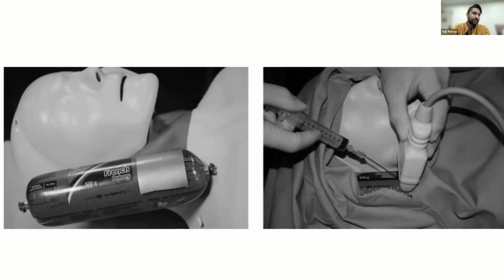They made the point in this article to say that a low fidelity phantom such as this one made out of sausage can actually be easily upgraded to create a more realistic experience for the candidate by attaching it to a more lifelike mannequin. So they've put the sausage on the shoulders of a mannequin and covered it in a blanket, which I guess you could do to help simulate the procedure a little bit more.